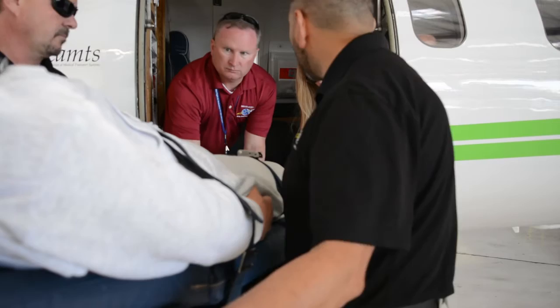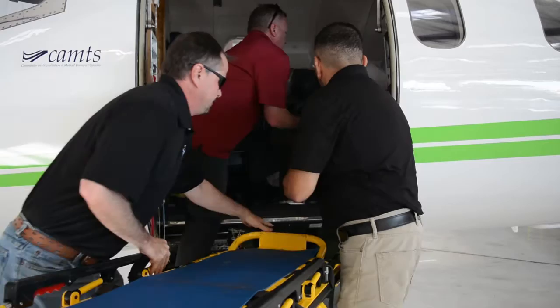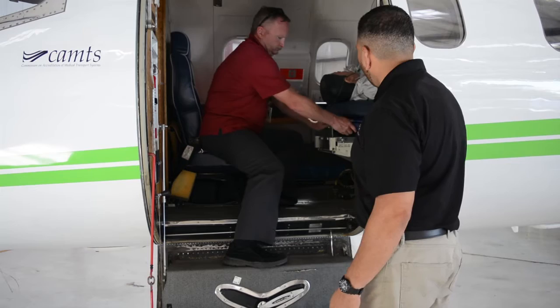Okay, so on three, everybody ready? One, two, three. So we're going to lift, taking it nice and slow. So once the patient is in, we're going to back the gurney away. You can see Aaron is going to position that sled so that it locks into place. We want to ensure that it's locked into place, making sure these latches are in on that.